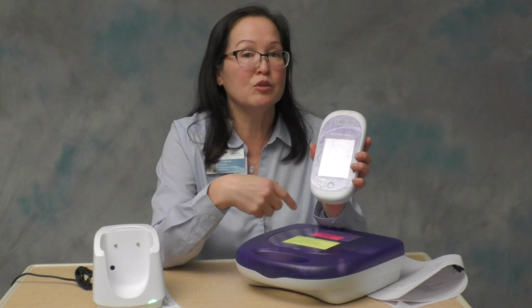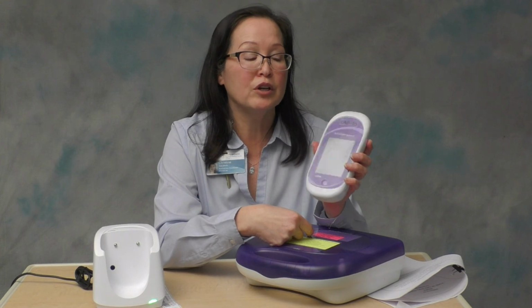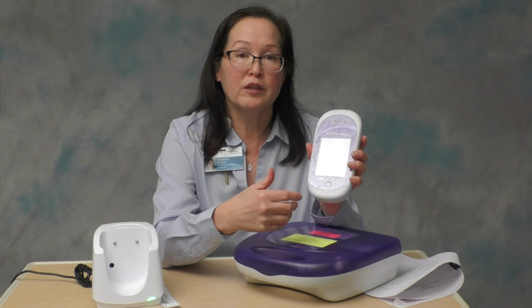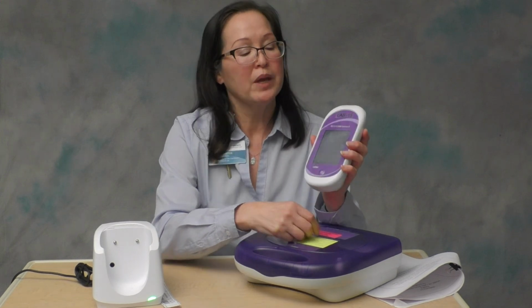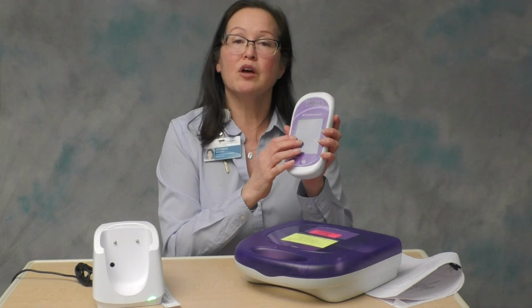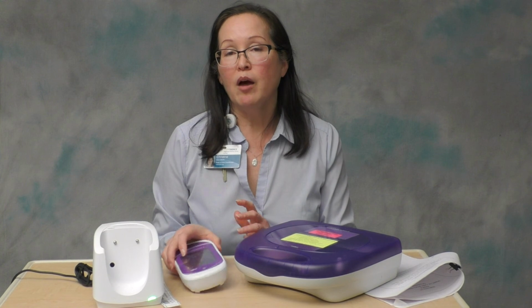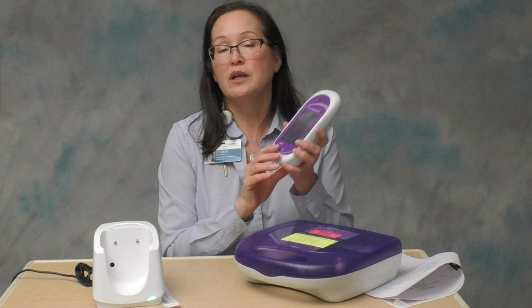So depending on the synchronization cycle of the software, it could take up to 30 minutes for your result to show up in Epic. So for that reason, we require that you manually document in Epic under your flow sheet using preliminary point of care glucose. So you've run your test, you've got your result, you've documented manually, you've treated your patient if your patient requires treatment, and now it is time to clean the meter.